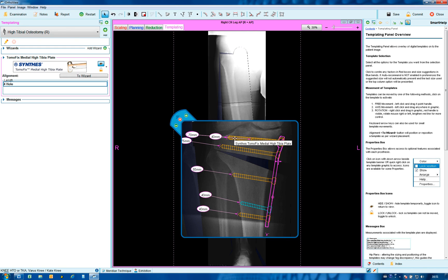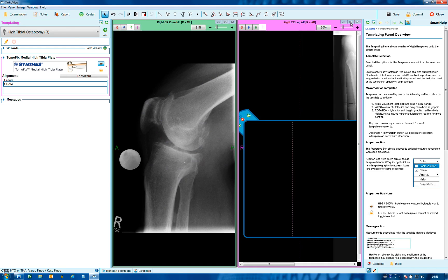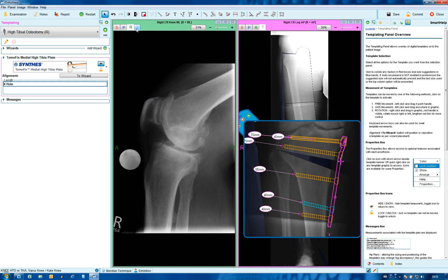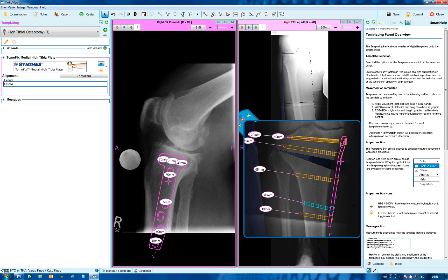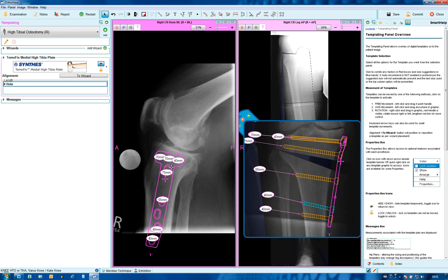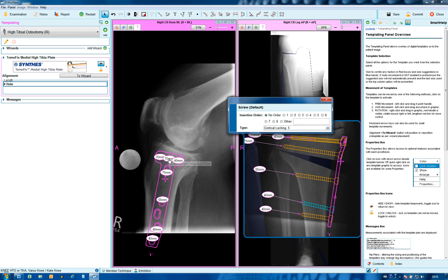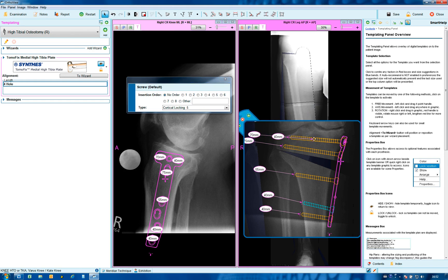Sometimes the lateral view is useful. Bringing in the lateral view and moving to templating, we see the plate with the screws that have already been adjusted. Remember the small arrow keys for small movements. Accessing the screw heads is easier in this view; removing the central screw and adjusting the remaining screws is more straightforward here.